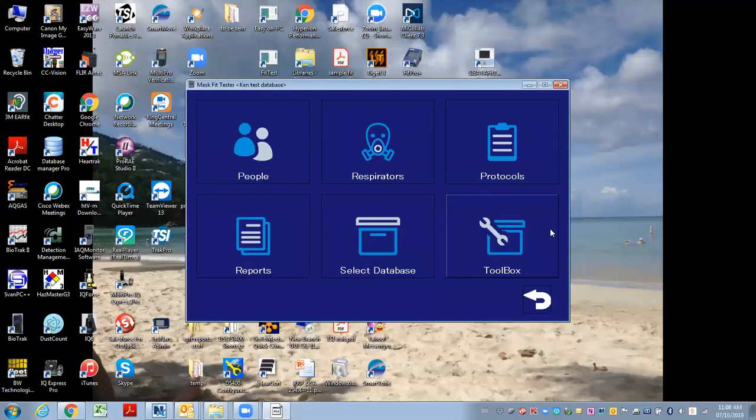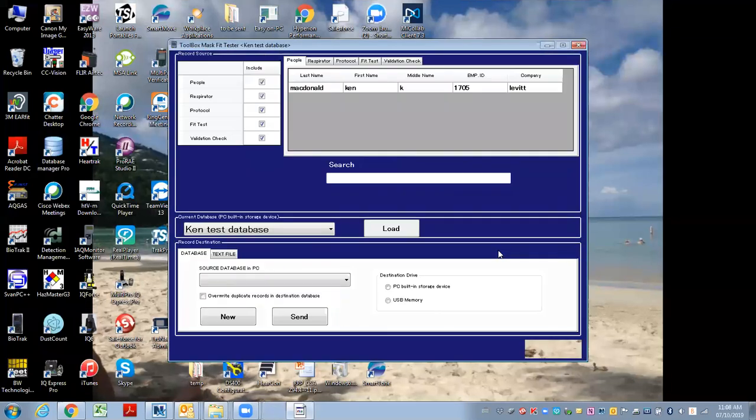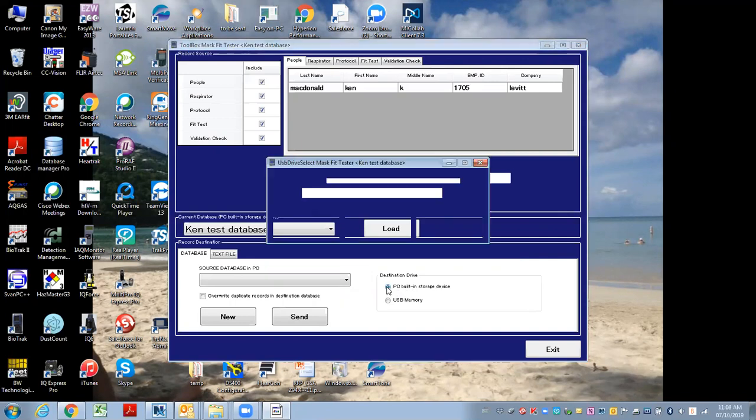So when I come back after doing my fit testing, I'd go back into the software and go to Toolbox. In this case, I want to import it into the PC built-in storage device from the flash drive, so I click this.